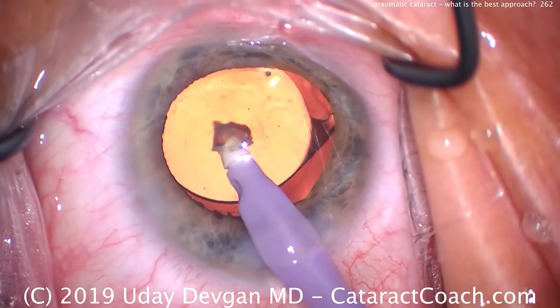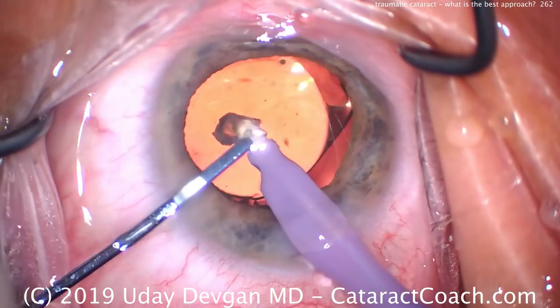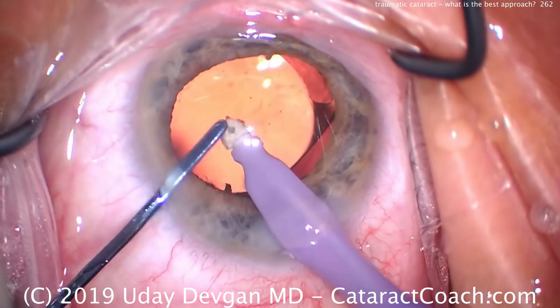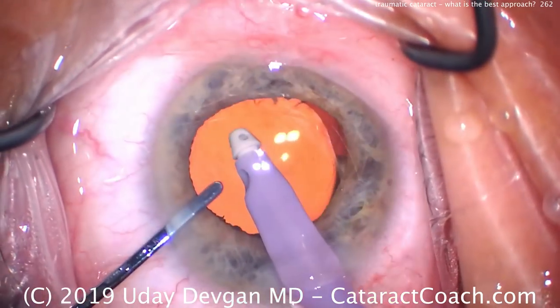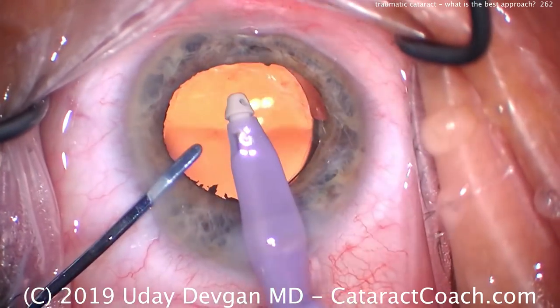And there's that last little piece of nucleus we saw earlier. We'll just bring that here to the eye port, use our spatula to just mush that into the port and aspirate it. So this patient did beautifully. Everything went great. Surprise, surprise. And he was absolutely thrilled with the outcome.